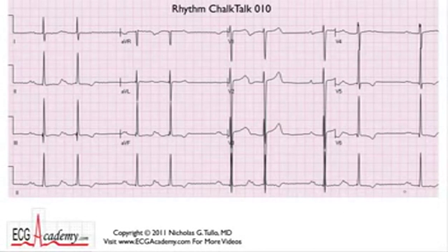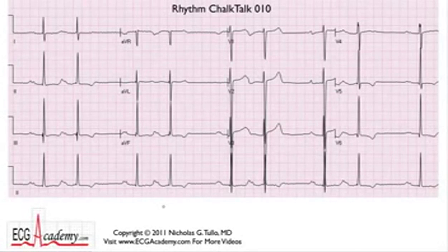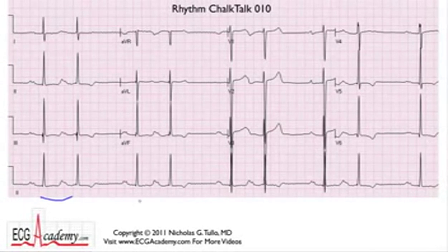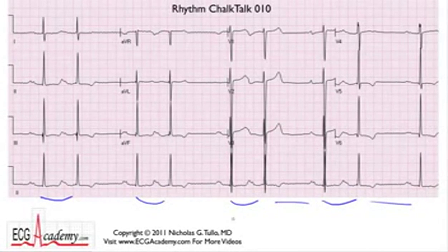Looking at the 12-lead, you can notice that there is an irregularity to it. But we talk about regularly irregular or irregularly irregular, and I think what you guys should be able to recognize is that there are groups of two — group beating with two beats followed by a pause and two beats followed by a pause.